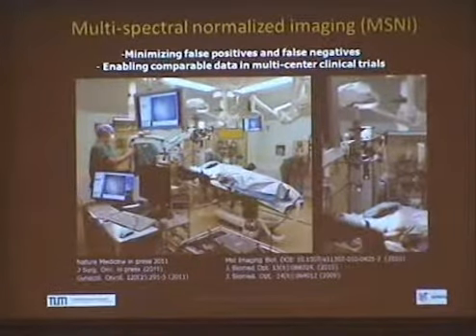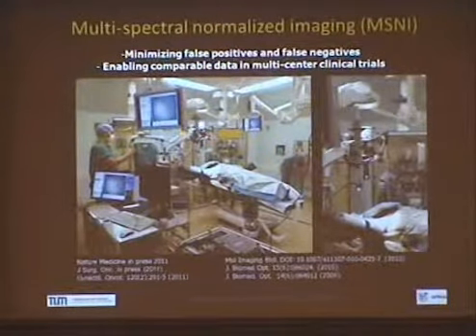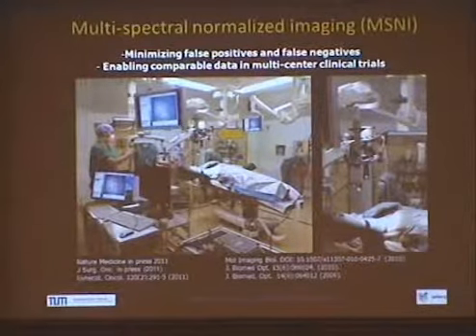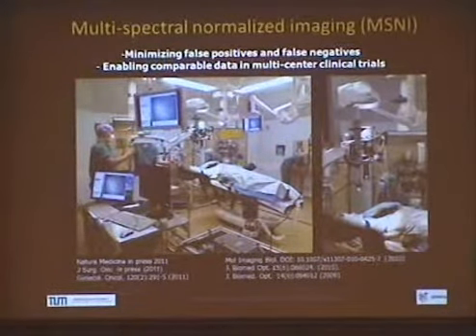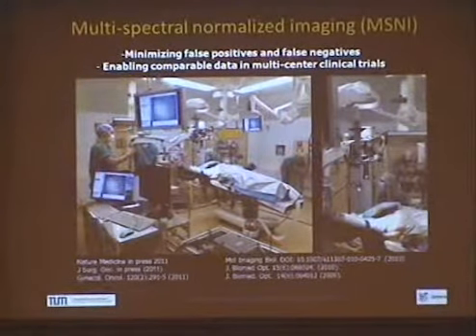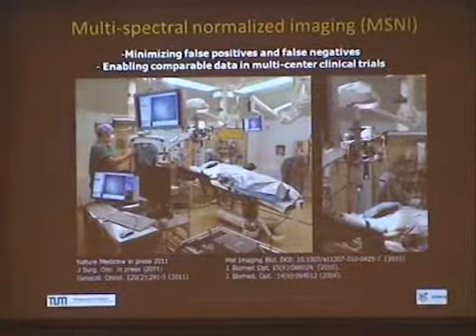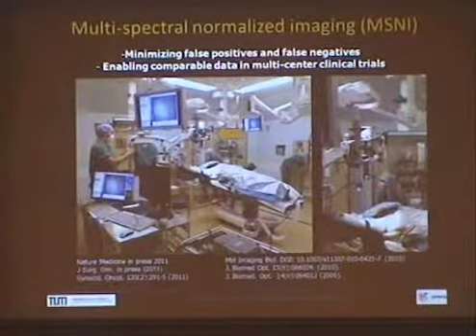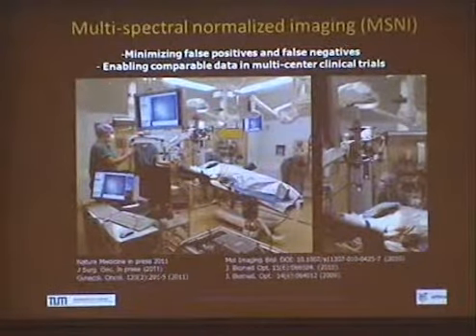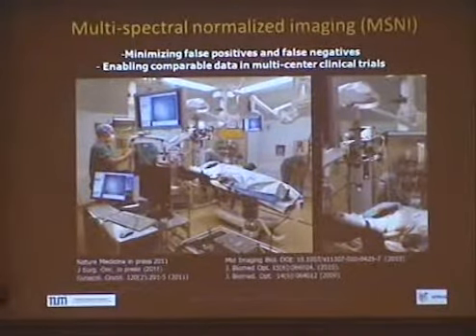So we took this camera into the operating room. Here you see the camera. Essentially, the camera is this 3-head camera. It has a common lens here, and I'll show you also implementations for endoscopy. There's a patient here prepared. This is for breast cancer surgery. Now, we plug the camera directly into the monitors that are already there in the OR, but we also have our own monitors. And the system is just based on a surgical arm used for a surgical microscope, and it's just rolled on top of the patient.